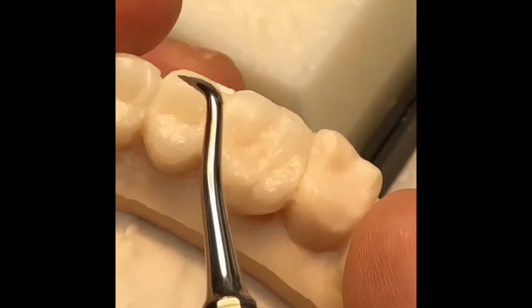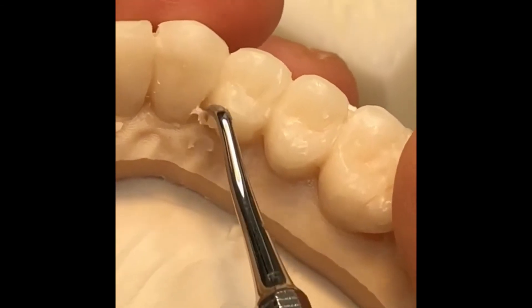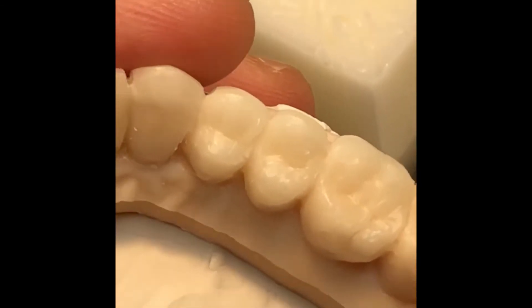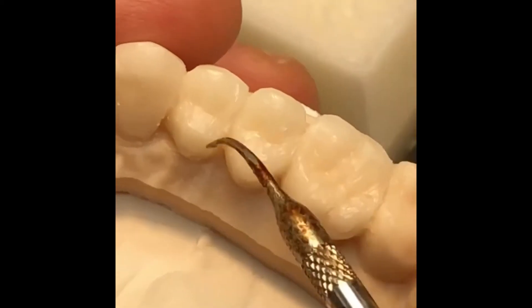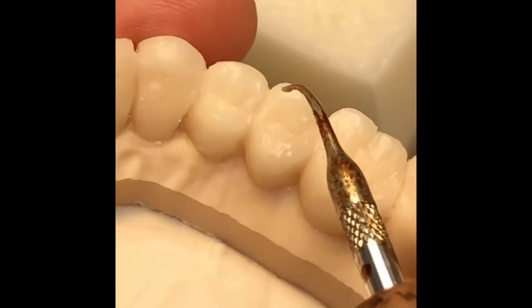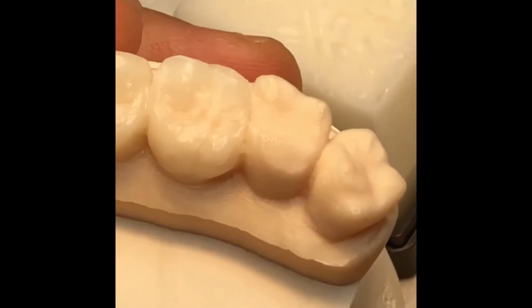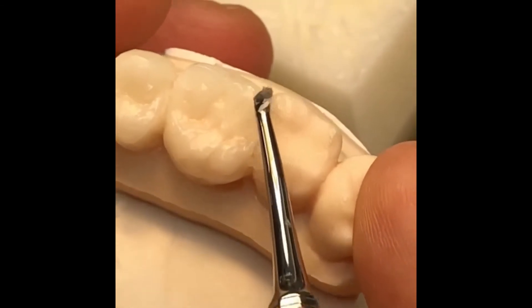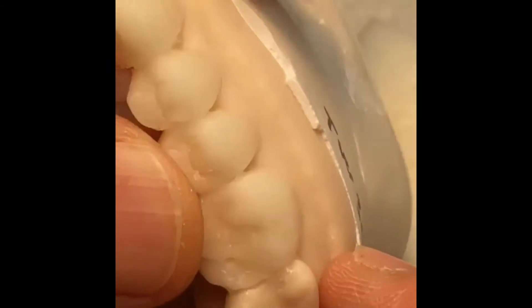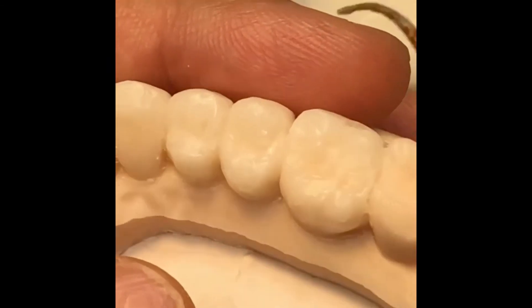Here is another format. Here is the first premolar, upper first premolar. So I have a ridge and here it is almost done. So I'm contouring between the tooth, this buccal contour, occlusion table, then I'm trying to finish up.